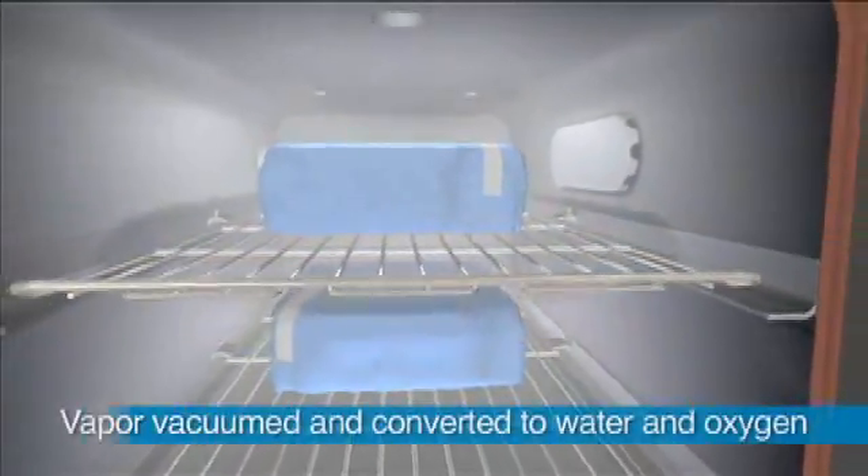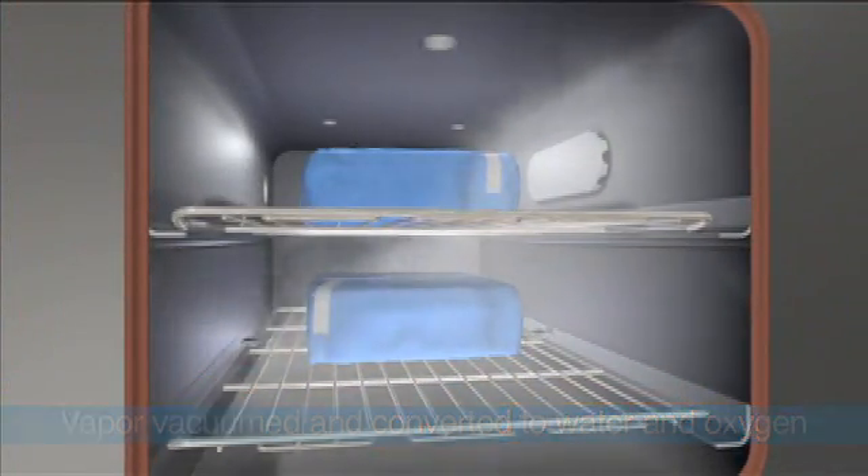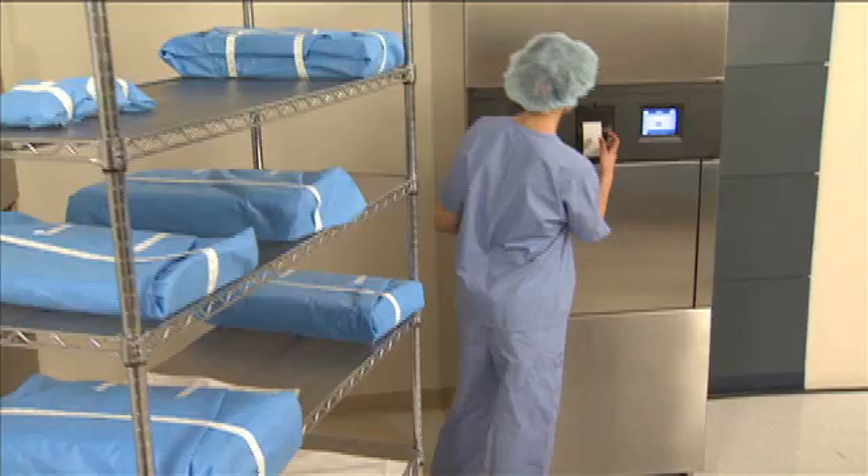After the sterilization phase, the vapor is vacuumed from the chamber and converted into water and oxygen. No ventilation is necessary.